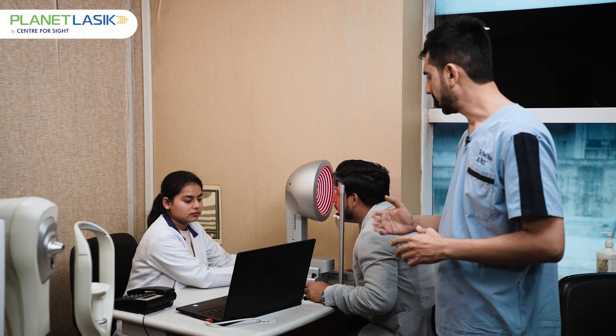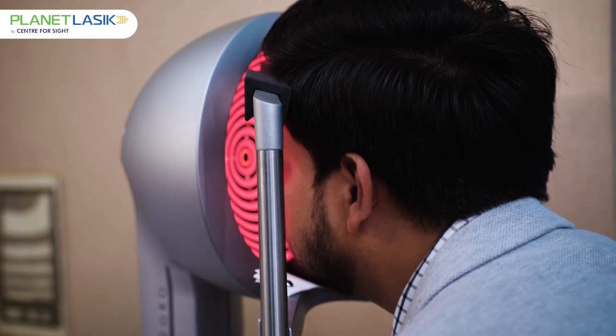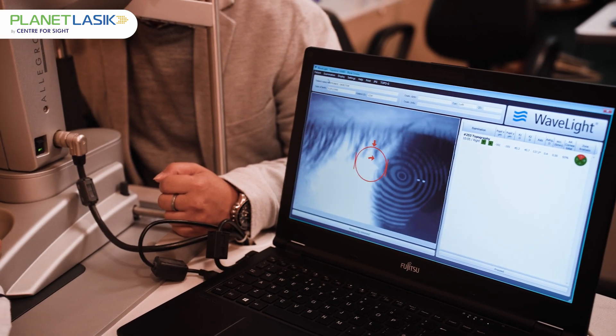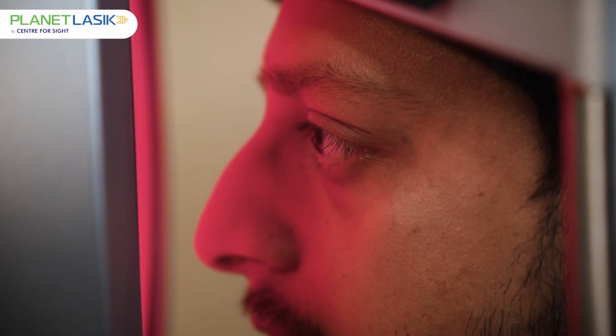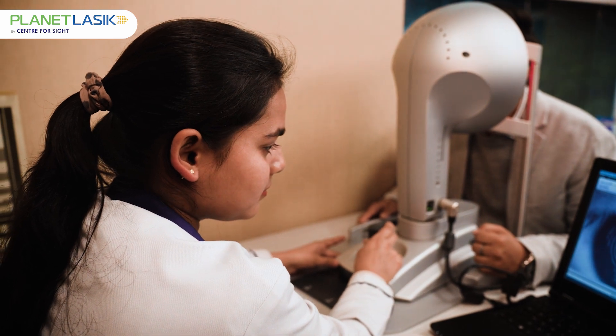This is the Allegro Topolyzer, which is used to detect higher order aberrations. More than a large number of points on the corneal surface are assessed, and minor irregularities on it are mapped, and this results in a successful Contura treatment.